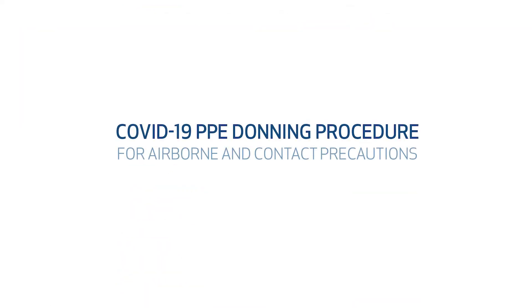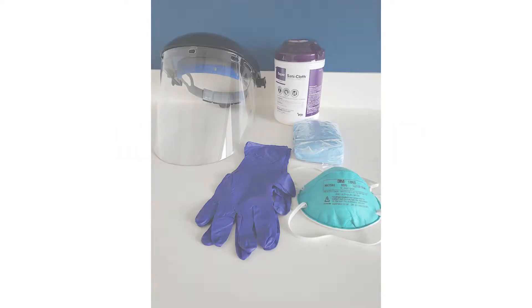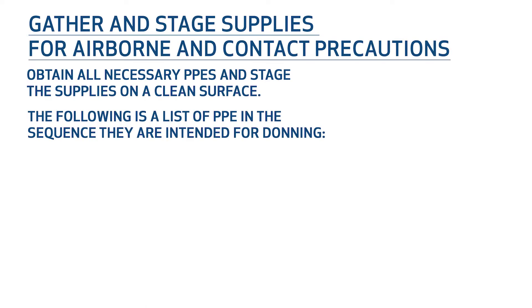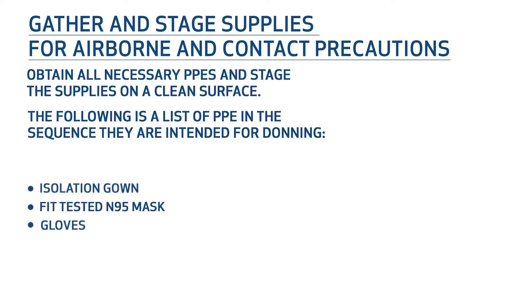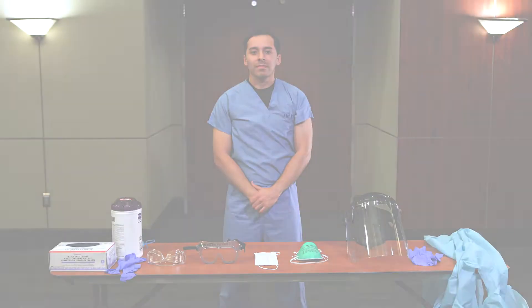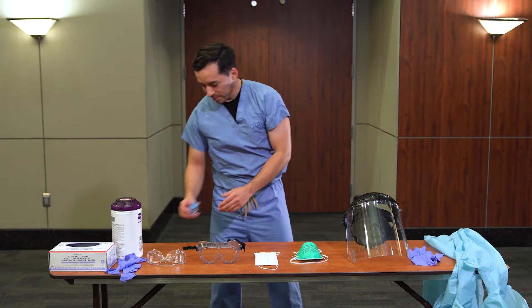The following procedure will be used for donning PPE for airborne and contact precautions. Gather and stage all supplies. Perform hand hygiene using alcohol hand gel or soap and water.